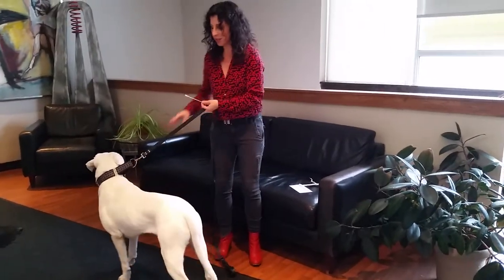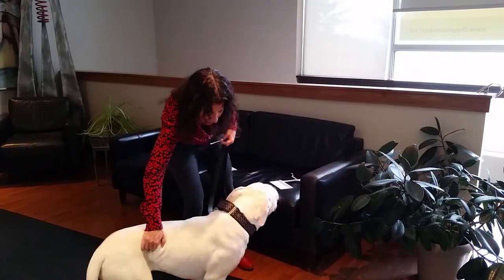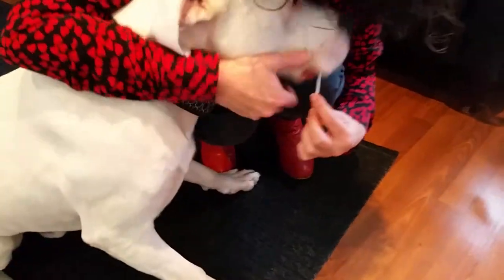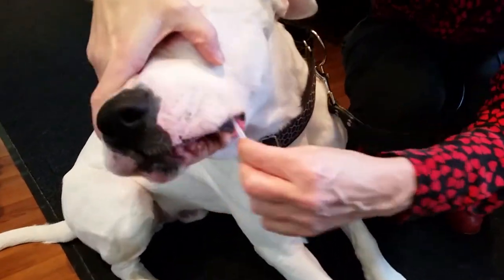Let's see how Harry is. Good boy. You're going to take the swab and you're going to put it inside the dog's cheek here, and you're just going to rub it for 20 seconds.